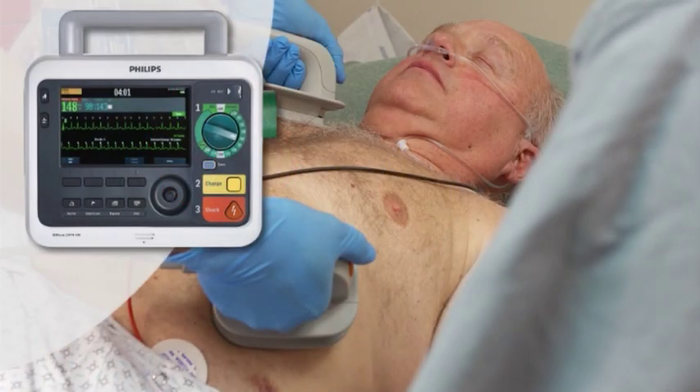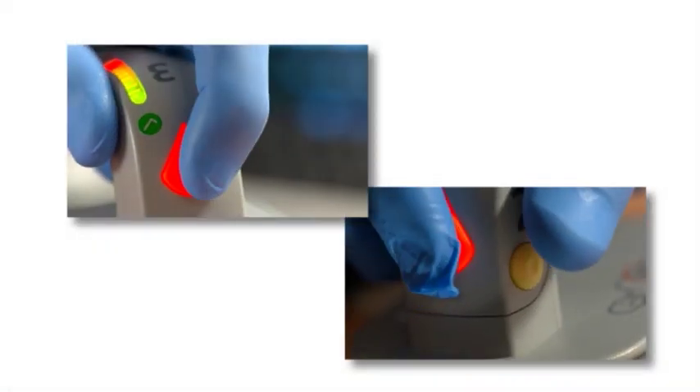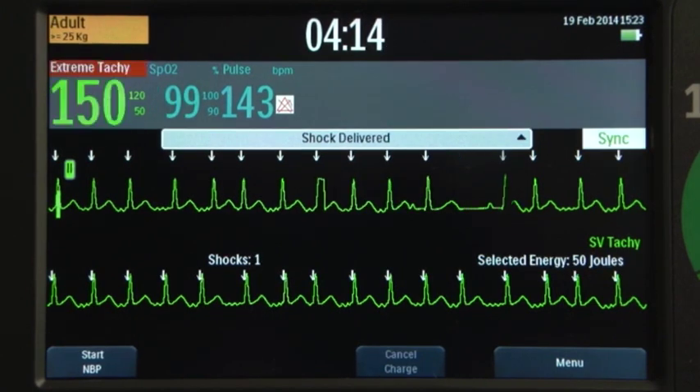Make sure no one is touching the patient or anything connected to the patient. Press and hold both shock buttons simultaneously, located on the paddles. A shock delivers on the next detected R wave.